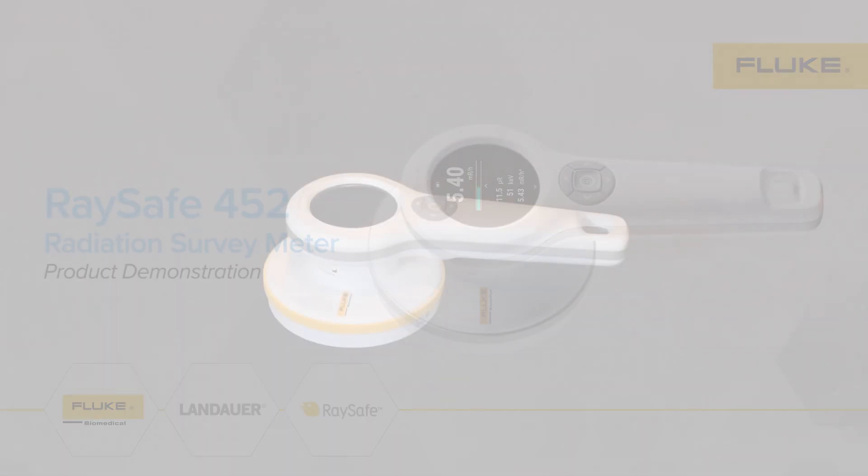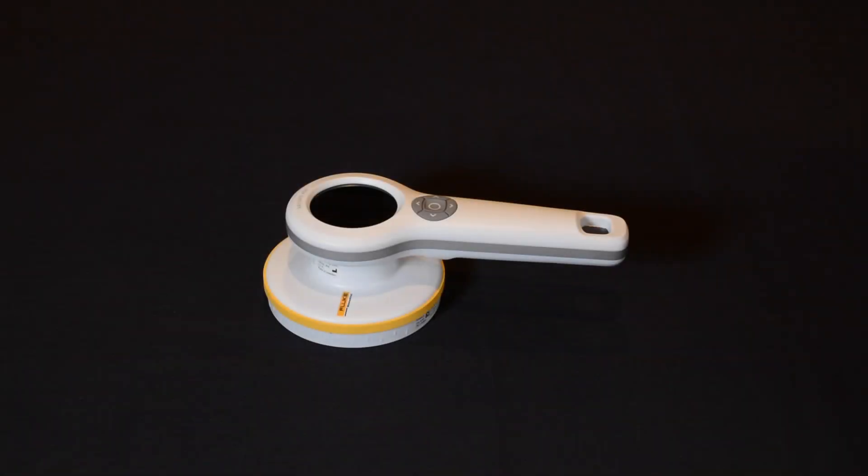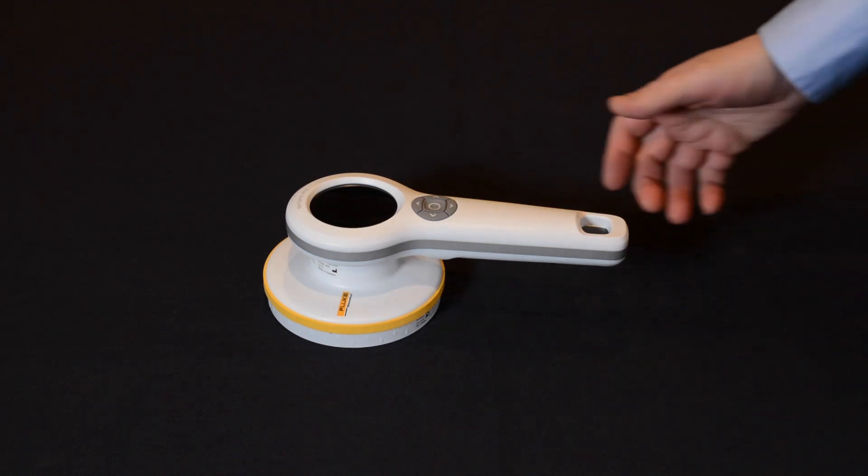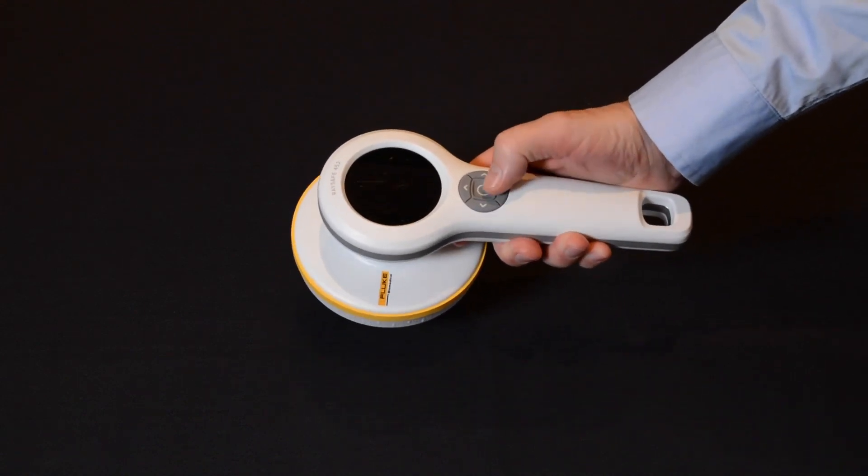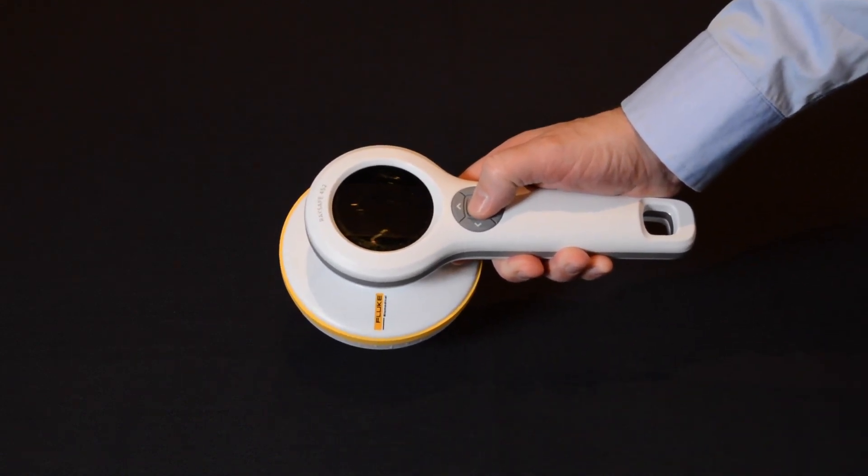This is the Raysafe 452, a new innovative survey meter that is designed to capture radiation in multiple ways with different definitions. This instrument is designed based on what you need as a user and not by the properties of the technique or application.